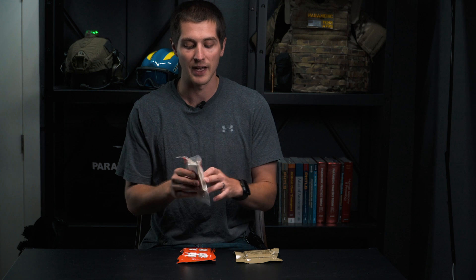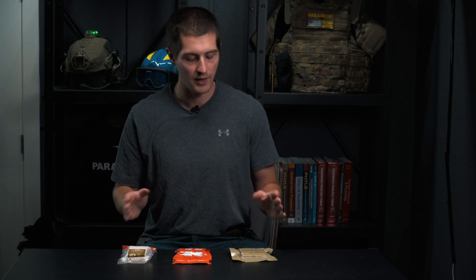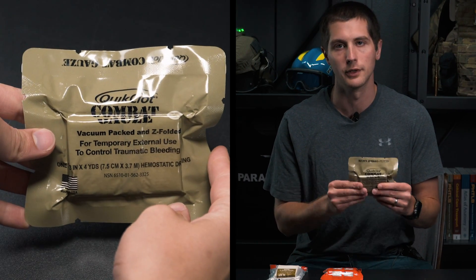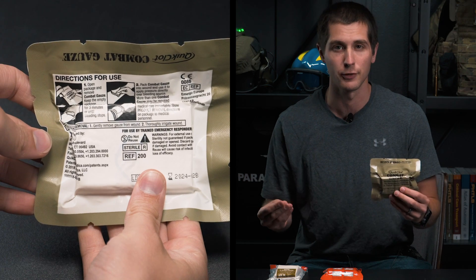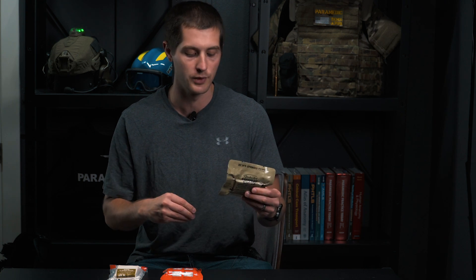A lot of people don't know that Quick Clot Combat Gauze and Cellox Gauze use different active ingredients to achieve clotting. Your Quick Clot Combat Gauze uses a mineral called kaolin, which is a clay oftentimes found in lawn products as well as some skincare routines. The kaolin will actually activate factor 12 of your clotting cascade as it comes in contact with the wound.